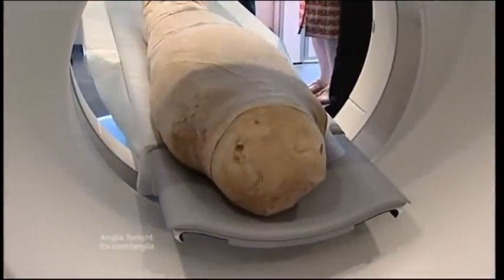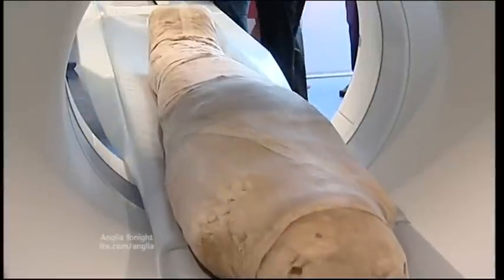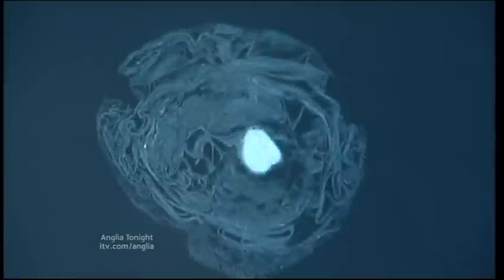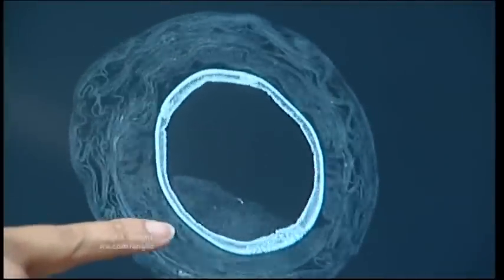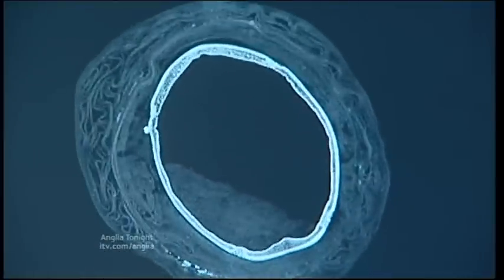Looking further down the body, you go into the heart. The heart has obviously been removed and put back in because there is an outline of the heart, but it's in a much lower position than it normally would be. But it's definitely sort of an appearance of a heart there. And you can actually see the position she was in as well, hands down on the top of her legs. All the bone condition is superb throughout, as if a living specimen. It's just exactly what you'd expect to see. The only thing we can see with the bone, the jaw is slightly dislocated, but you can see the fingers right down to the toes and the outline throughout. Fascinating stuff. Thank you very much.